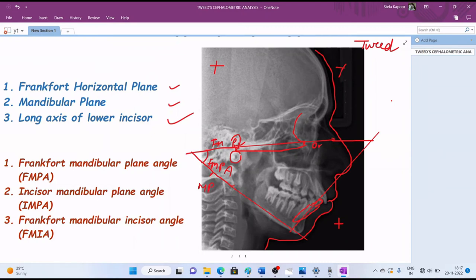The second angle is incisor mandibular plane angle, IMPA, which is formed by the intersection of the long axis of the lower incisor and the mandibular plane. The third angle is FMIA, which is formed by the intersection of Frankfurt horizontal plane and the long axis of the incisor.